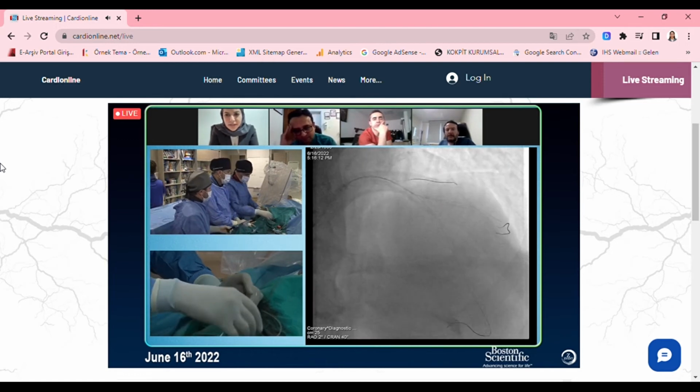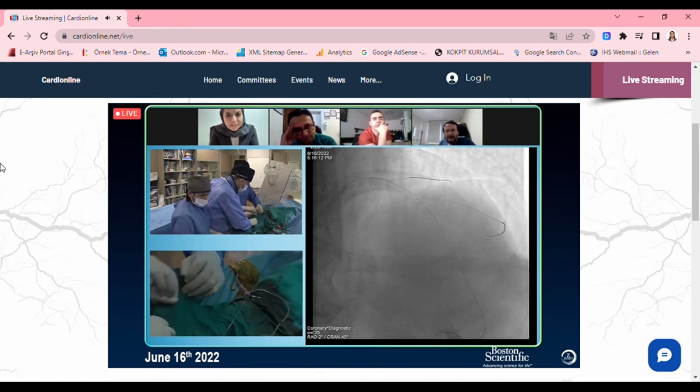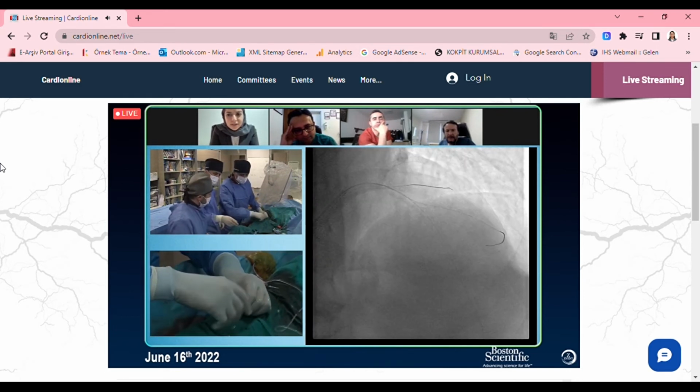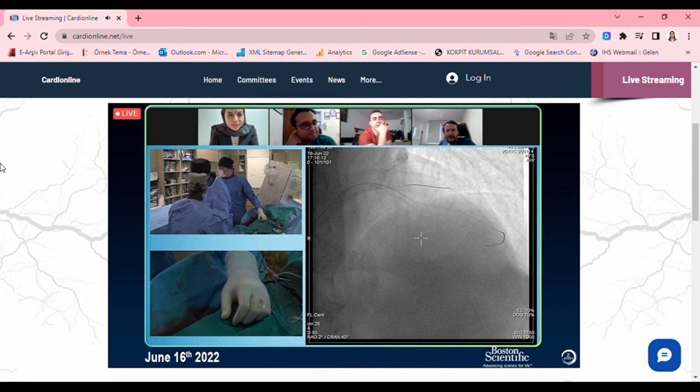Once you deal with that diagonal, see if you have time to show us an IVUS run, if you put all of this to the council.